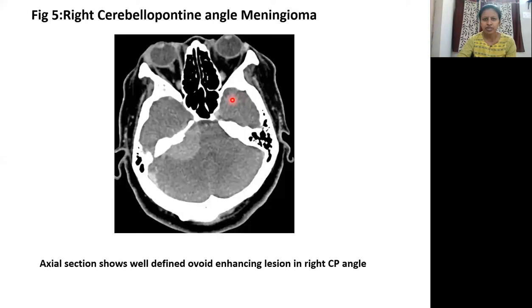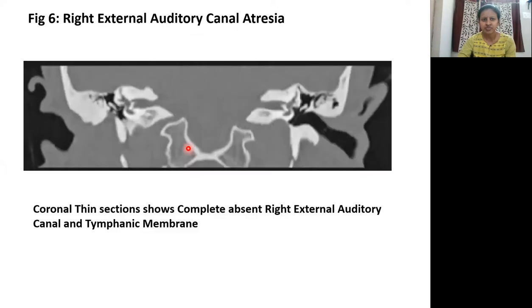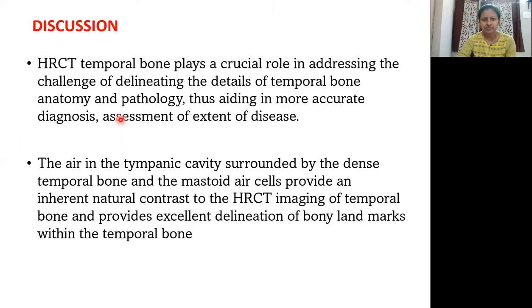This is a case of right cerebellopontine angle meningioma. Here we see a well-defined enhancing lesion in the CP angle. This is a case of right external auditory canal atresia. In this image, we see a complete absence of the external auditory canal and the tympanic membrane.